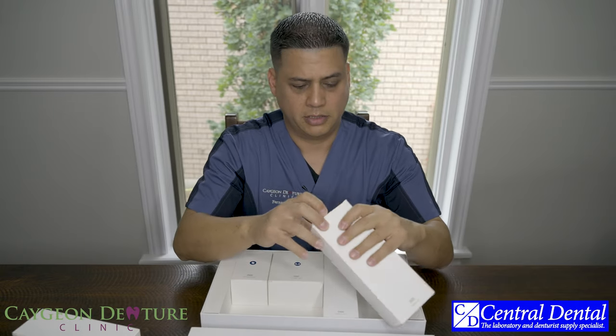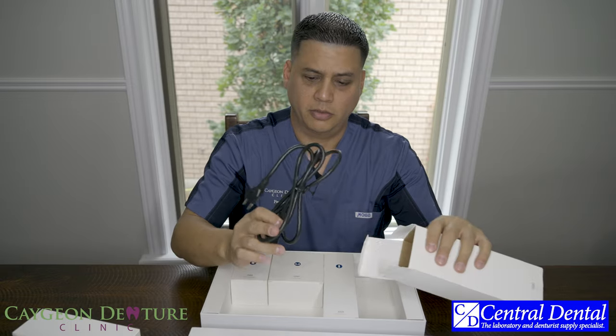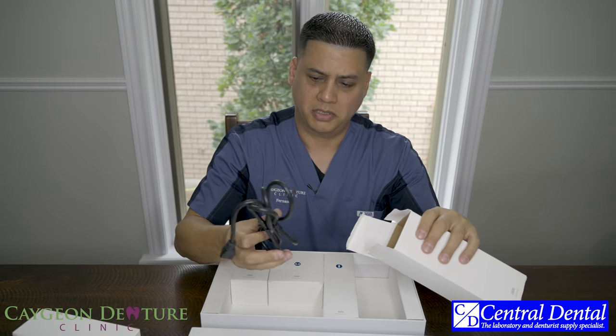And then here we have just the power cord. Once again there is some length to it — I believe it's about six feet.